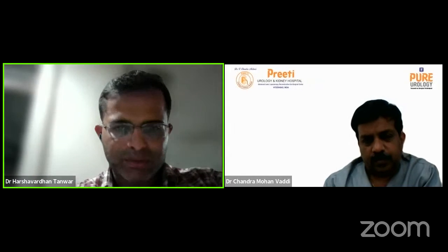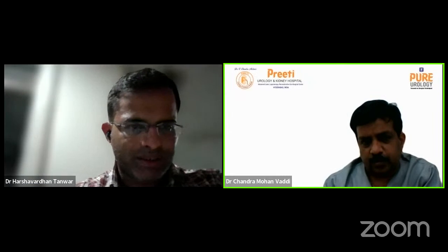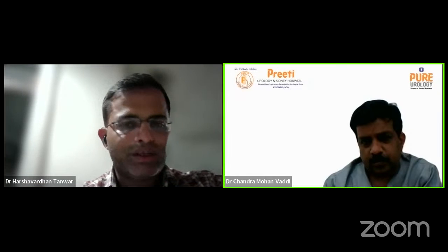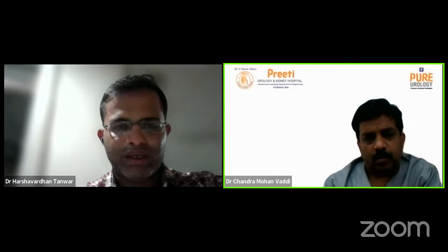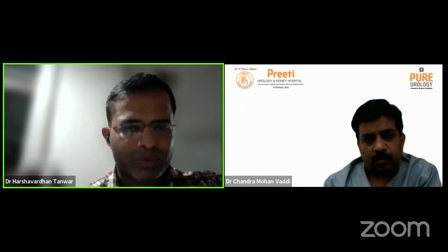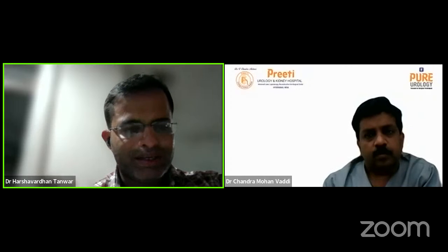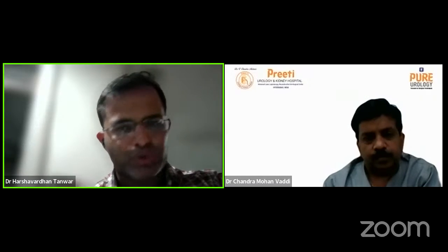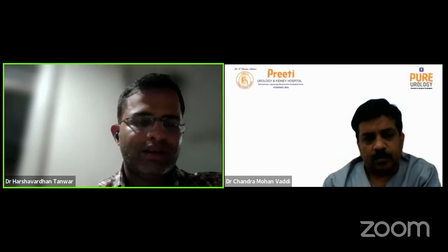Many times, 90% of the times, we are able to successfully puncture in monoplanar technique. This was the same question asked in the live conference also by a delegate, that whether you always follow. I am not rigid, sir. No surgeon should be rigid with his techniques that I will do only this, I will do only that. When you are doing a PCNL, you have to give justice to the patient by clearing the stone, and you have to be flexible. You should know all the techniques. You practice one technique, but you should be thorough with all the techniques. If one technique is not doing well, you have to switch.